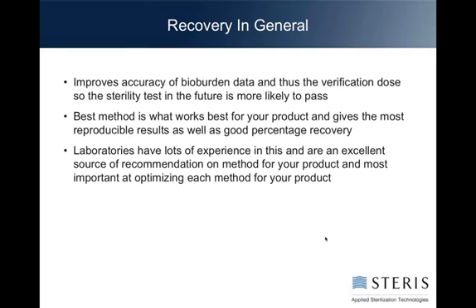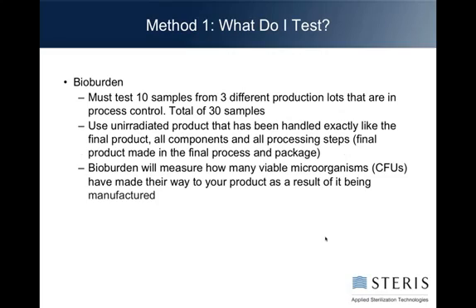Keep in mind, laboratories have a lot of experience in this and are excellent sources of recommendations for the better method. They're also going to have seen many different kinds of products, some that are very similar to your product, and may have good ideas on what methods for extraction will work best.